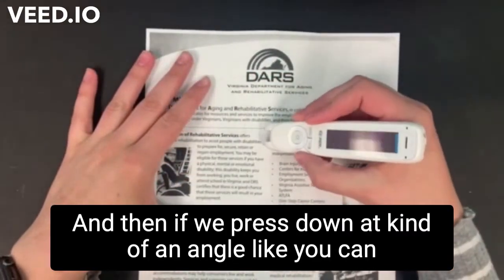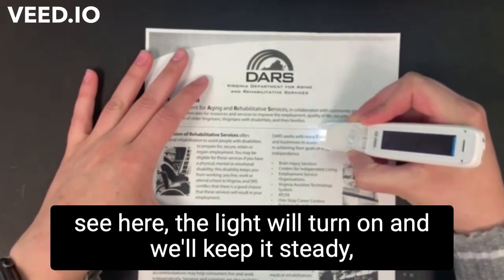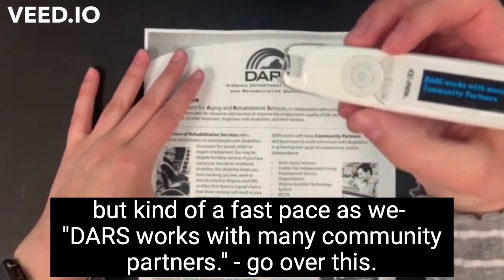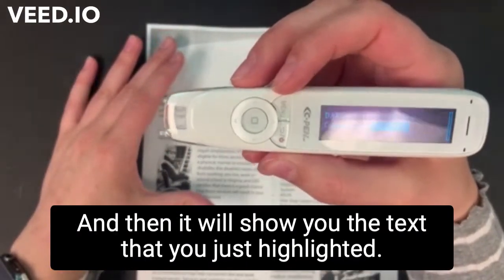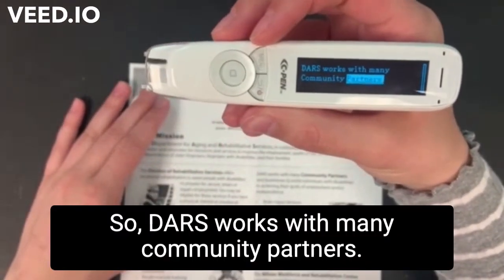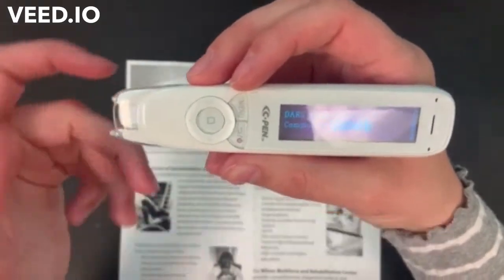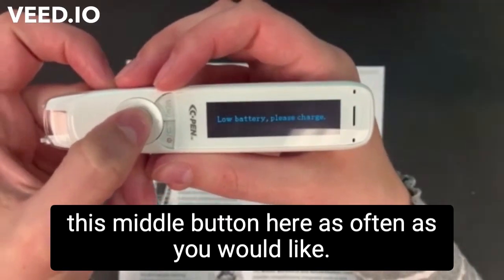If we press down at kind of an angle like you can see here, the light will turn on and we'll keep it steady but at a fast pace as we go over this. And then it will show you the text that you just highlighted. So 'DARS works with many community partners' — it has that on the screen here. And then if you want it repeated, you can press on this middle button here as often as you would like.